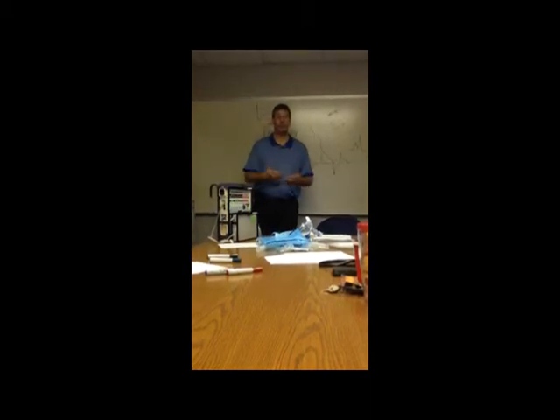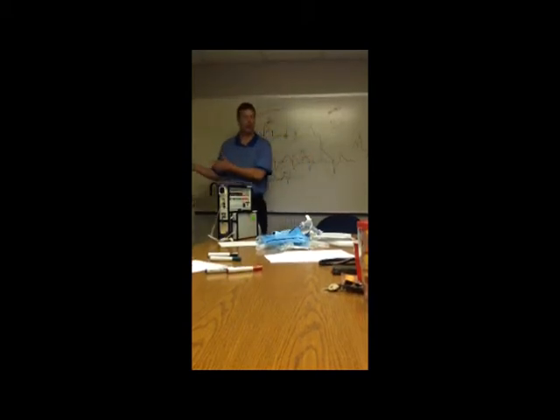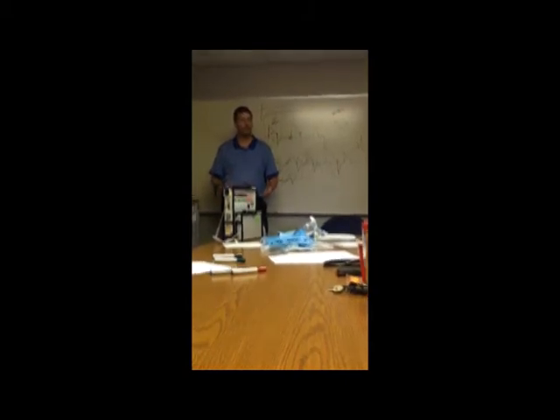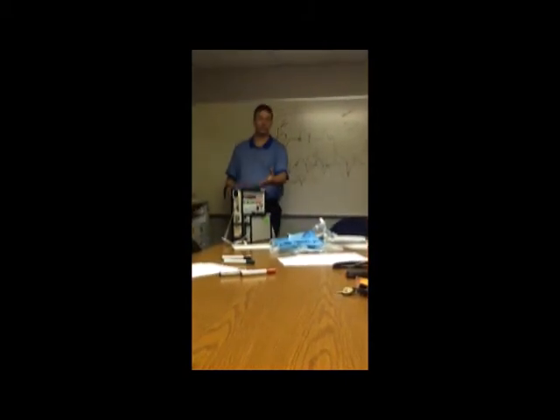If they're on less than that, I can probably get that with a cannula. I can go 6 on a cannula. And I know we've been taught for years, don't go above 6 liters on a cannula. It's not good for you. You have to have the high flow to go higher than that. It's true in a sense, but it's more long-term true. Short-term, for an hour, if you're at 8 liters on your cannula, you're not going to kill them.